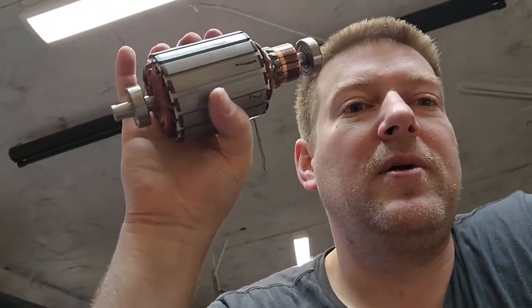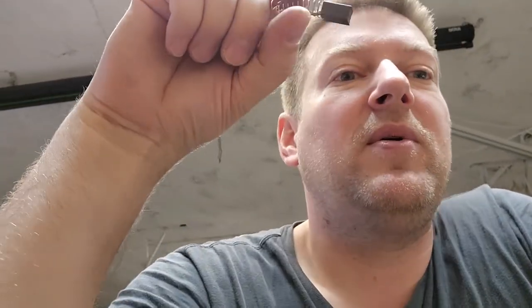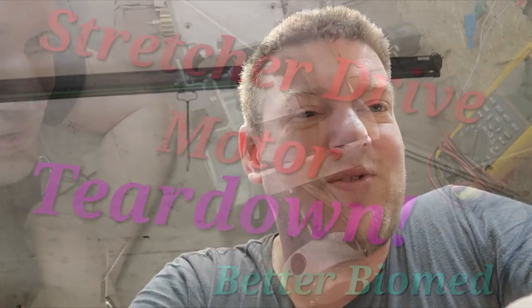There you go - a stretcher drive motor. It's a fascinating piece. They took a lot of care when they manufactured this part and they use premium components. That's all I've got for you on stretcher drive motors - four-pole DC brushed motor. It looks interesting and I'm glad I snagged this part from the trash to show you what's inside. Let me know what you think - I'll probably be doing more of these common teardowns, so let me know if you want more videos like this one.